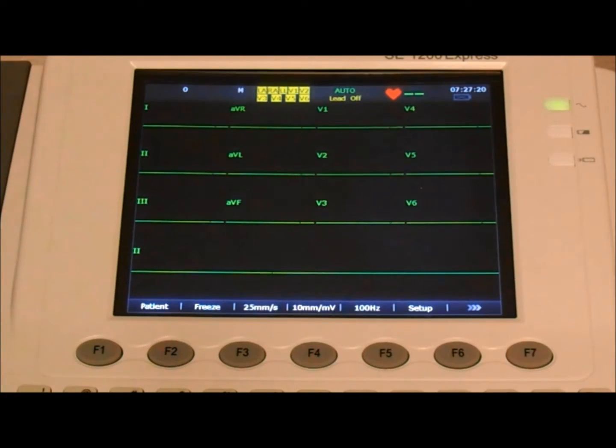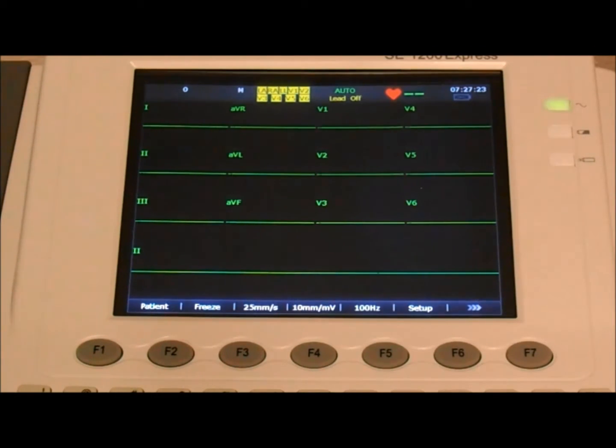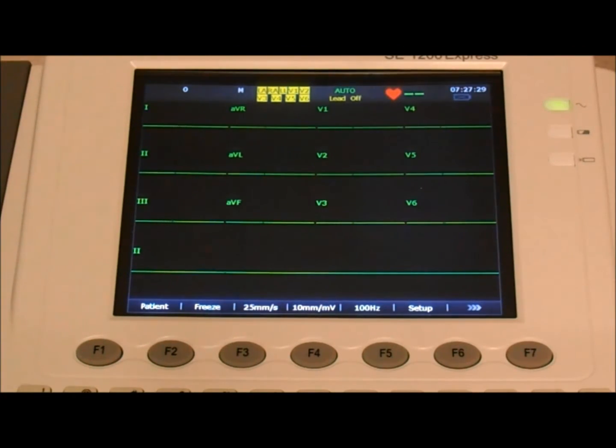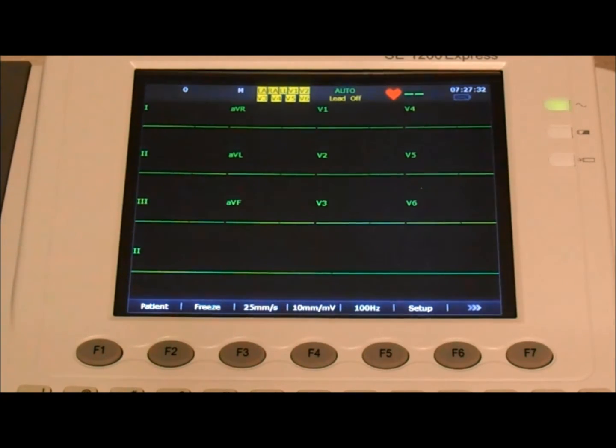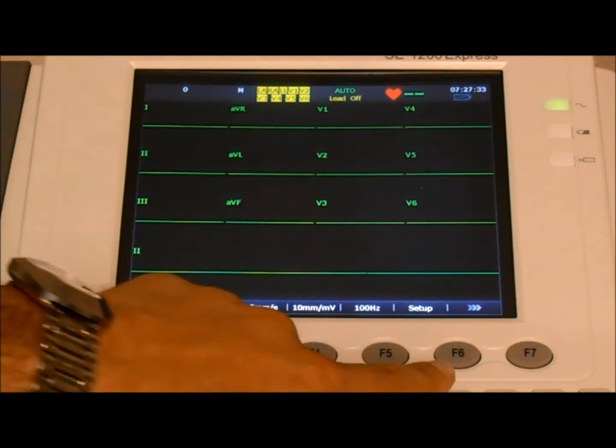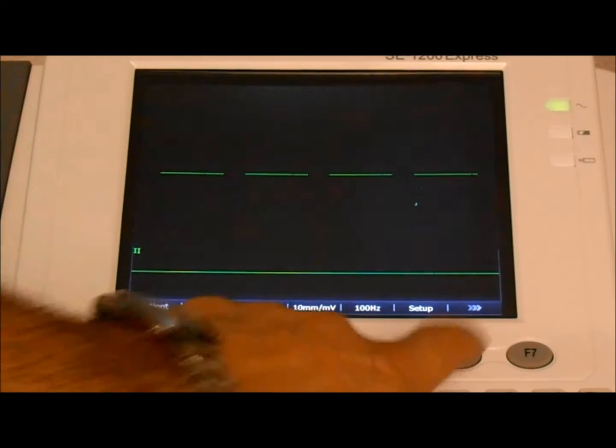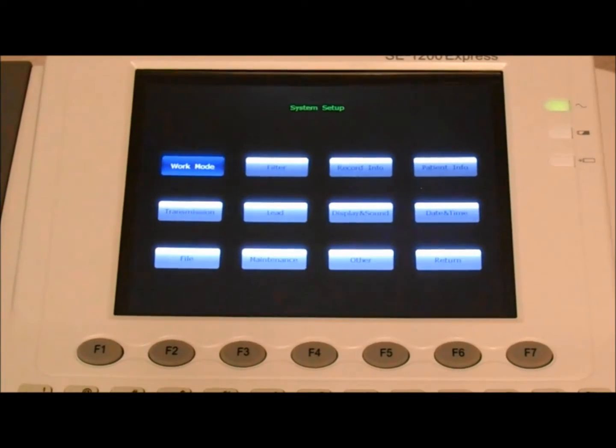This video provides guidance on how to set your EKG system, that is your EDEN EKG system, to perform a 10 second report with interpretation. After you power the ECG, you want to press F6 to enter the system setup.